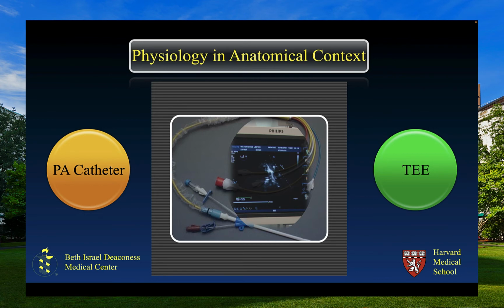We traditionally use the pulmonary artery catheter to measure intracardiac chamber pressures, measure the systemic vascular resistance, the pulmonary vascular resistance. But little is known that TEE is a very established physiological monitor. Also, a lot of people call it a PA catheter in a box, which just goes through the esophagus but gives almost essentially the same information.